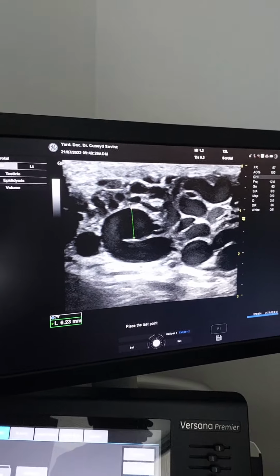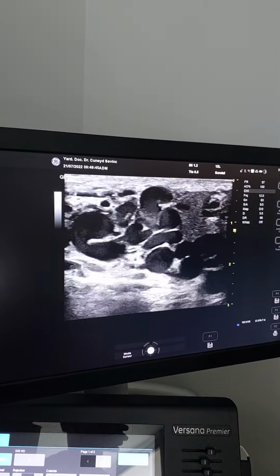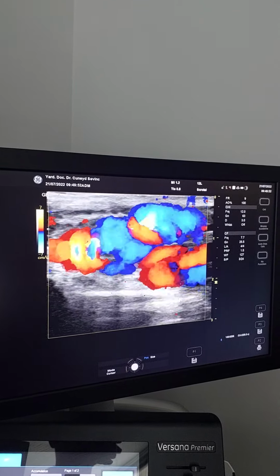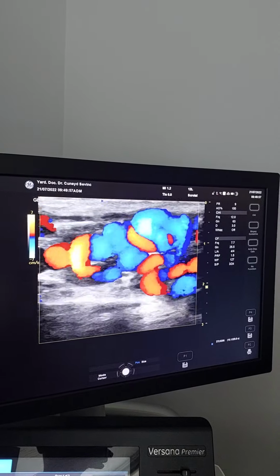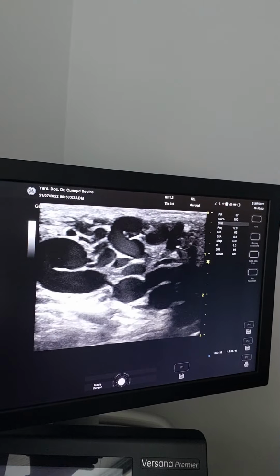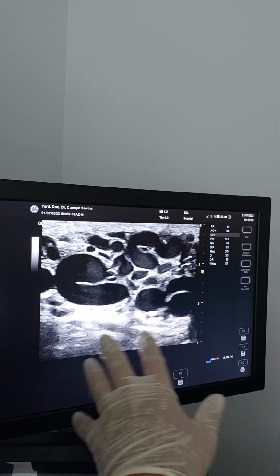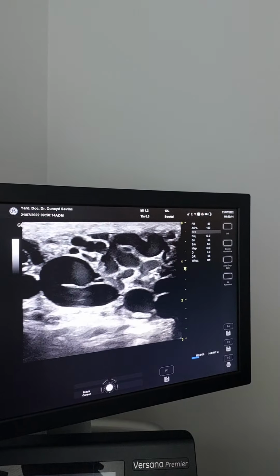So this is one of our main differences. I don't want just to palpate and make the diagnosis, but I want to see with Doppler, because sometimes when we send this patient to the radiology department, they look with the patient in the laying down position and the veins become smaller. And I want to see what I will face inside the operation, what I will see, because sometimes even when we see these veins, when the patient lays down in the operation and sleeps, they disappear. And sometimes we say, oh, there is no vein, but it's not true.